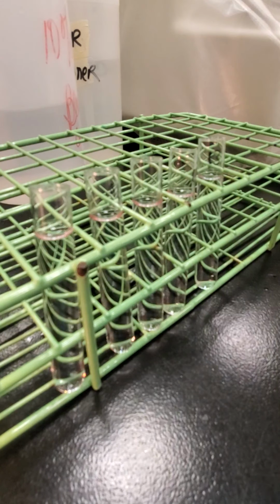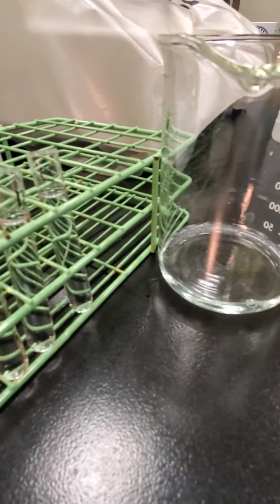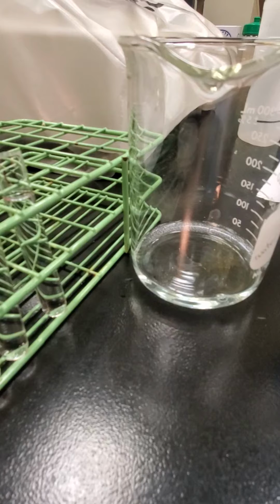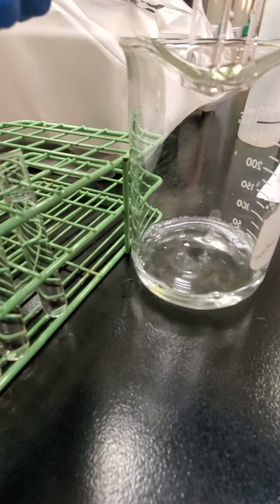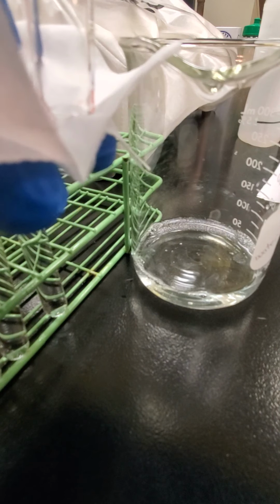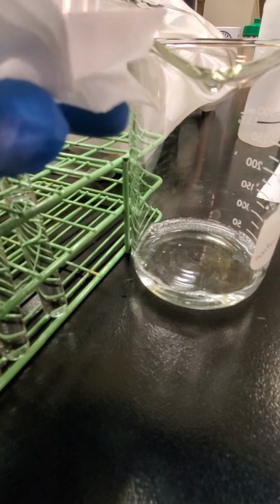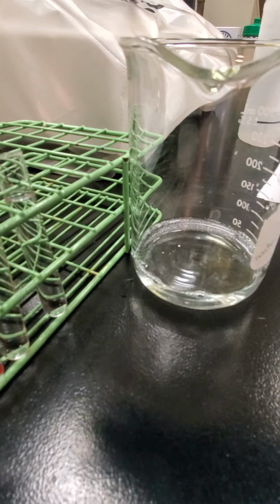Okay, so I just pulled my tubes out from their 4th wash. I wanted to show you guys this. I'm going to dump them, keep them inverted, and then tap the tubes to get that extra saline out of there. That wasn't a very good demonstration. Let me try it again.